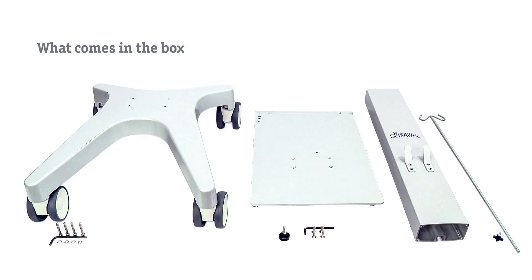Before starting, gather these parts and tools: cart base, screw kit for the cart column, cart top, thumb screw, screw kit for cart top, cart column, cord holder, and thumb screw for cord holder.